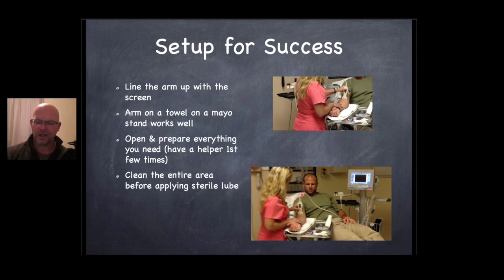But here, this nurse can look across and see the screen very easily, and the vessel. And that's the difference, because you're not watching your hands like you do with a regular IV. One hand's doing one thing, the other hand's doing another, and your eyes are across the room or wherever your screen is, and that's what you're watching. So it takes a little bit of getting used to, but the more you have everything out, open, and ready, the better off you'll be.